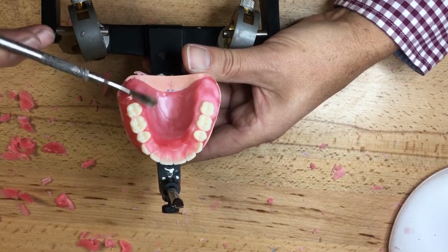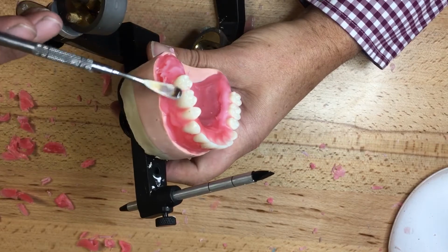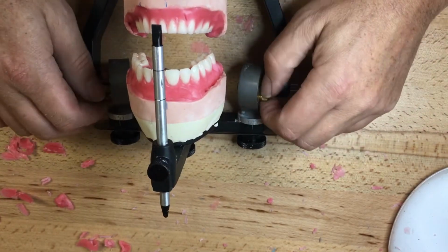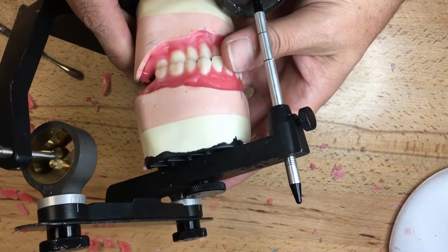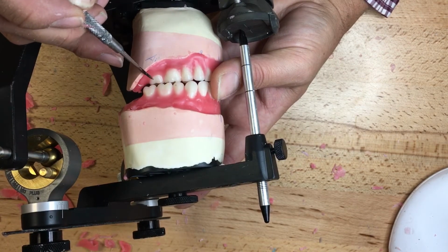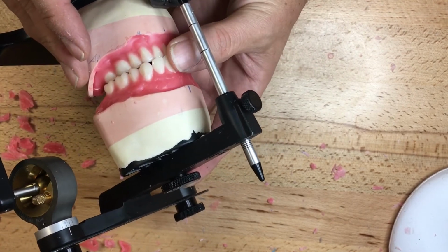So I'm just waiting for this wax here to set up as I'm going around cleaning some of the excess wax, adding some, anticipating my wax up. I know I'm going to put some compensating curve in right now. So I'm going to loosen the condyles. I would start with protrusive movement, which is really obvious to see the space I'm missing here on compensating curve. So how much compensating curve do I need? That much. My anterior stops, I've held them with my finger here. They're touching each other.